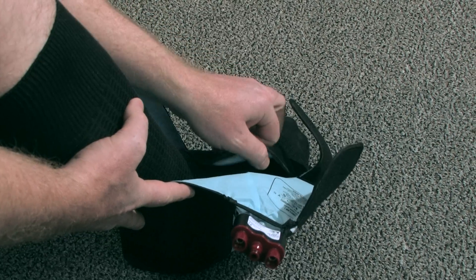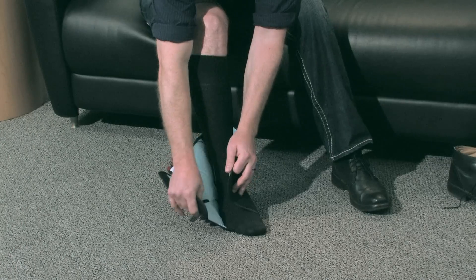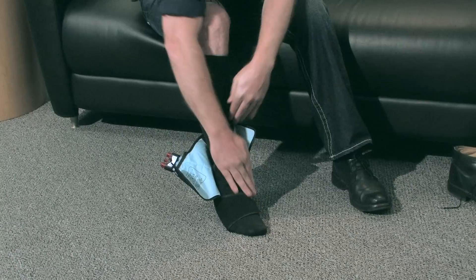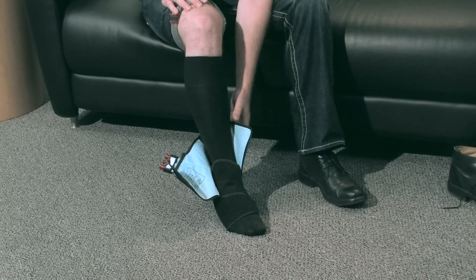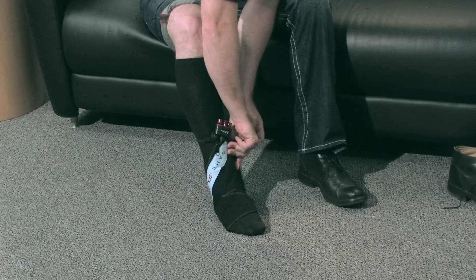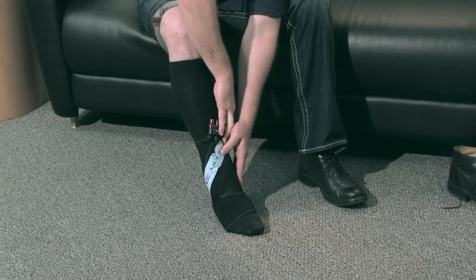Grab the left flap closest to the toes and fold over the top of your foot. Fold the right flap over the left flap and secure. Finally, locate the left flap near your shin, hold it against your shin, and secure the right flap on top.